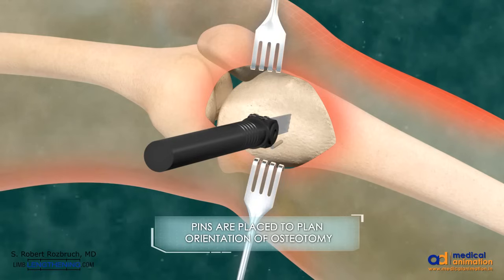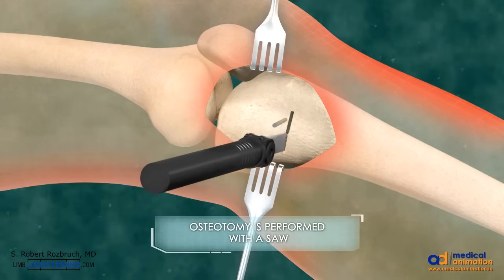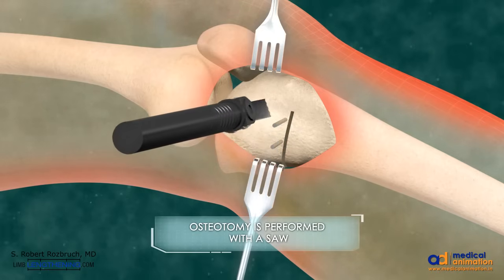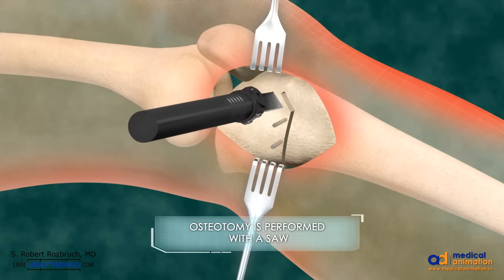The osteotomy is started on the medial side and follows the orientation of the pins. The anterior part of the osteotomy is oblique, so as to avoid the tibial tubercle. The lateral cortex is not cut.